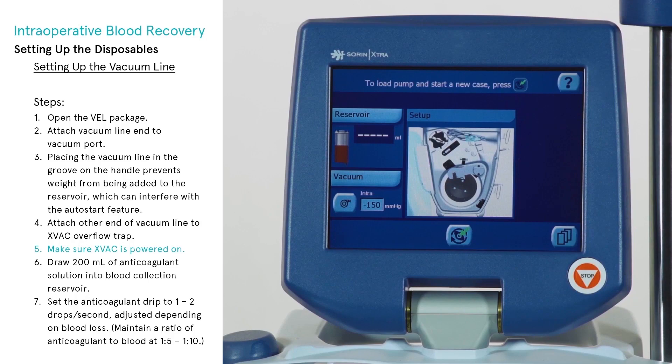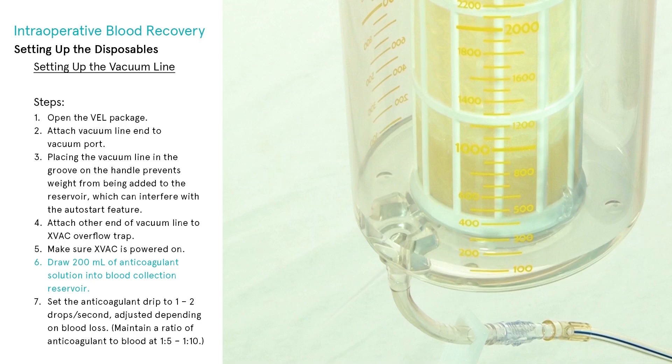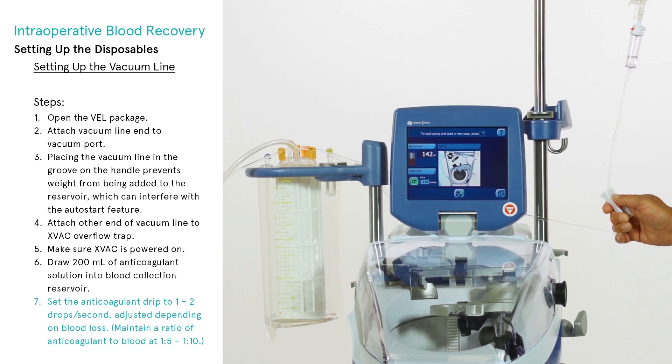If the X-VAC has not yet been powered on, do so using the vacuum key on the display. Open the roller clamp on the AAL and allow 200 milliliters of anticoagulant solution to be drawn into the blood collection reservoir. This volume should ensure adequate wetting of the reservoir filter and breakthrough to outside the filter. Finally, set the anticoagulant drip to 1 to 2 drops per second.